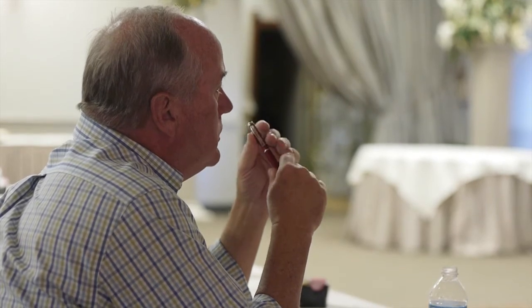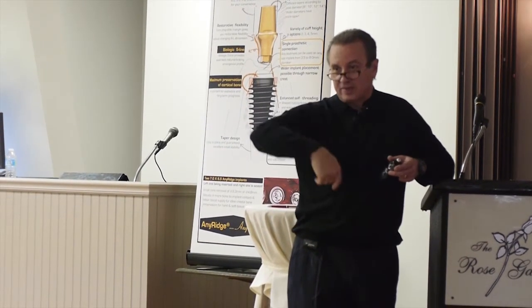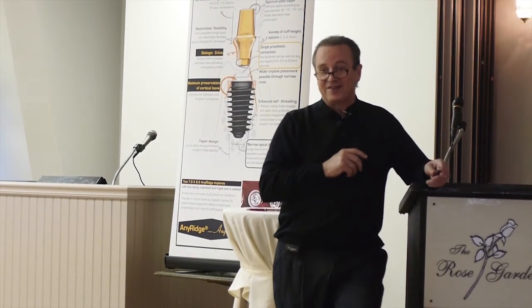Do you ever use your piezo for ridge splitting? Yes. Yeah. It's the ticket. It really is. In fact, back when we were doing blade implants, I wish we'd have had a piezo back then, because you could cut a perfect slot and you could put that implant right in there instead of trying to use a hand piece and all that stuff. By the way, my mom still has a blade. It moves, but she can eat with it.